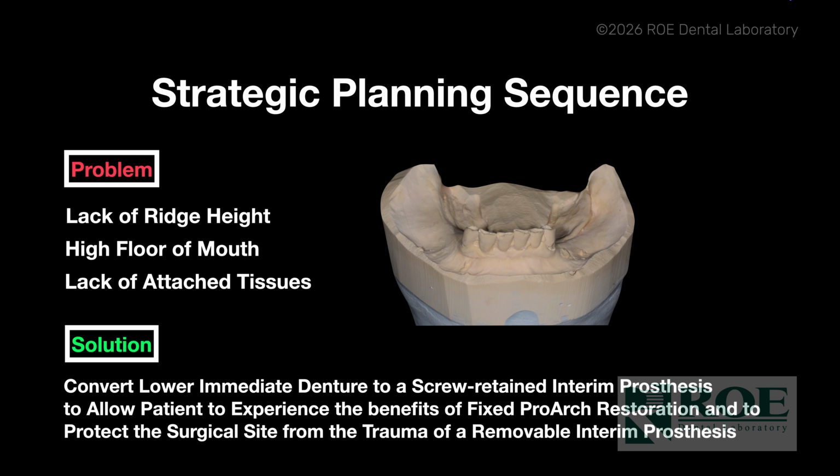So between myself and the surgeon, out of the kindness of our hearts, we decided that we were going to just do a screw-retained immediate load prosthesis on the day of surgery to help and protect that surgical site.